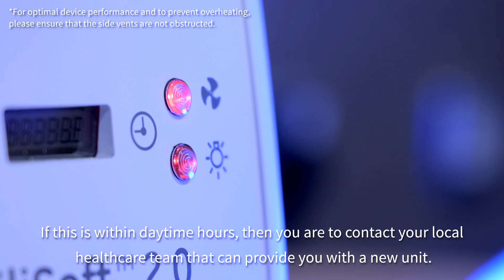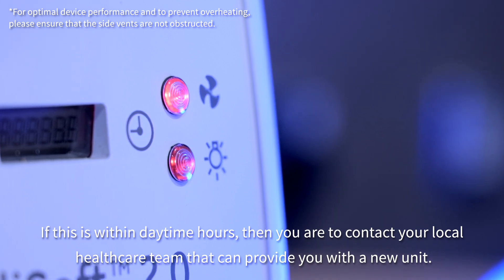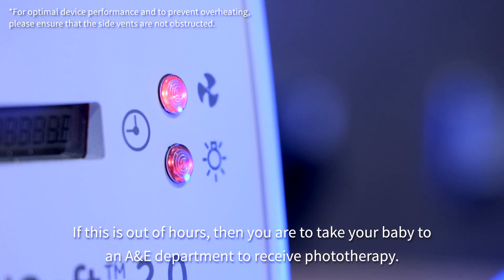If this occurs during daytime hours, contact your local healthcare team who can provide you with a new unit. If this is out of hours, take your baby to the A&E department to receive the phototherapy.